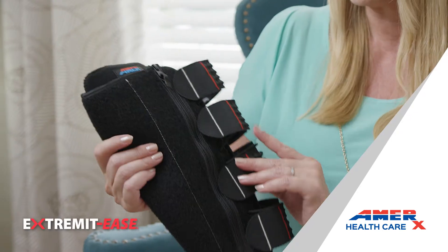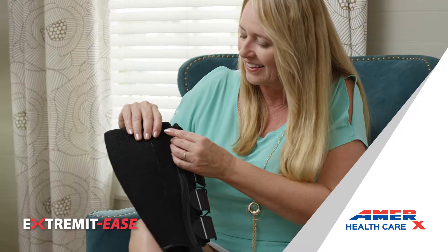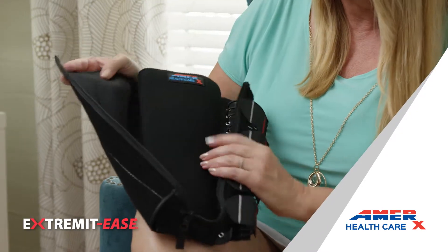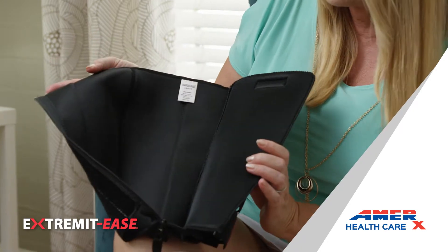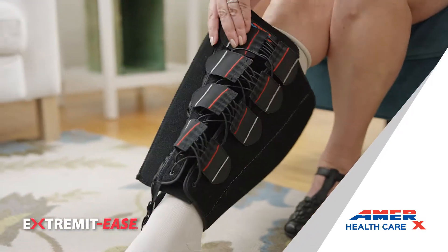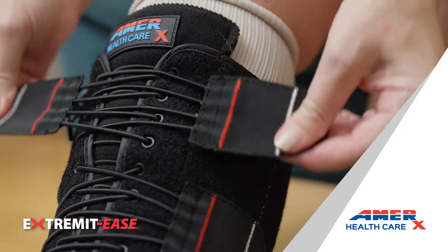The unique combination of zipper and bungee cords with large tabs used by Extremit-Ease makes application and adjustment as easy as one, two, three — even for those with dexterity issues. Simply slide, zip, and compress.